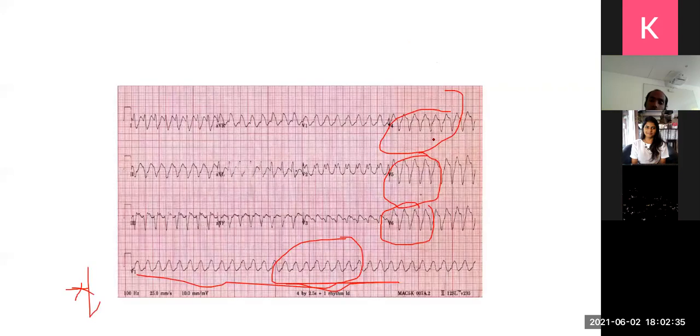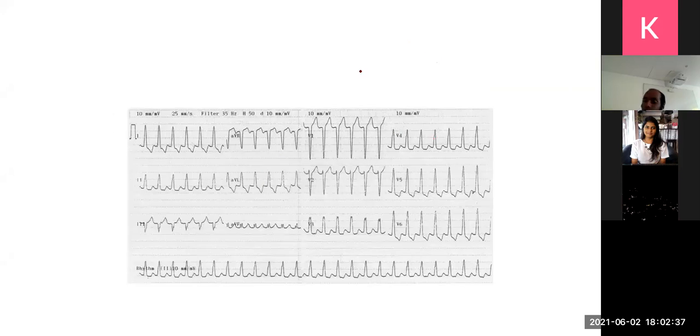Again, ventricular tachycardia. Ventricular tachycardia, however, is not the only reason for broad, abnormal-looking QRSs. There are some other reasons. Some toxins can cause broad abnormal QRS complexes. Certain other problems can cause it too. So just find out what those are for homework.